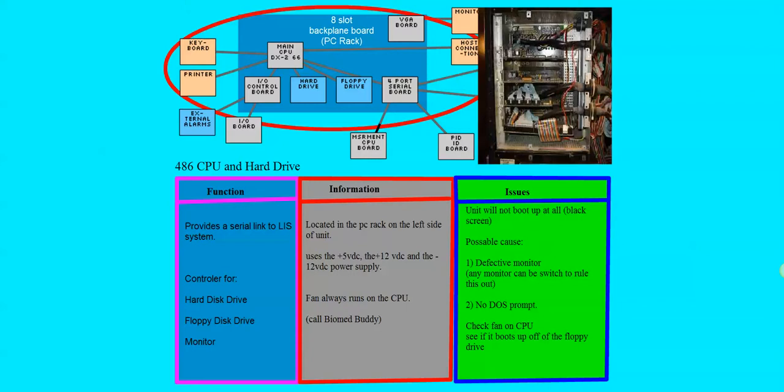Pretty much an off-the-shelf hard drive, and it controls STA software and the DOS 6.2 software. In general, by taking the cable and changing the connector on the cable and going through the setup, the BIOS setup, you can change this unit so that it will boot up using the floppy disk drive. Put in the 6.2 software, run ScanDisk. If ScanDisk works fine, you can assume that your hard disk drive is okay. You can also put in a service disk and go directly to ScanDisk through the DOS prompts, which you get to by going through the service menu. We will discuss that at a later point.